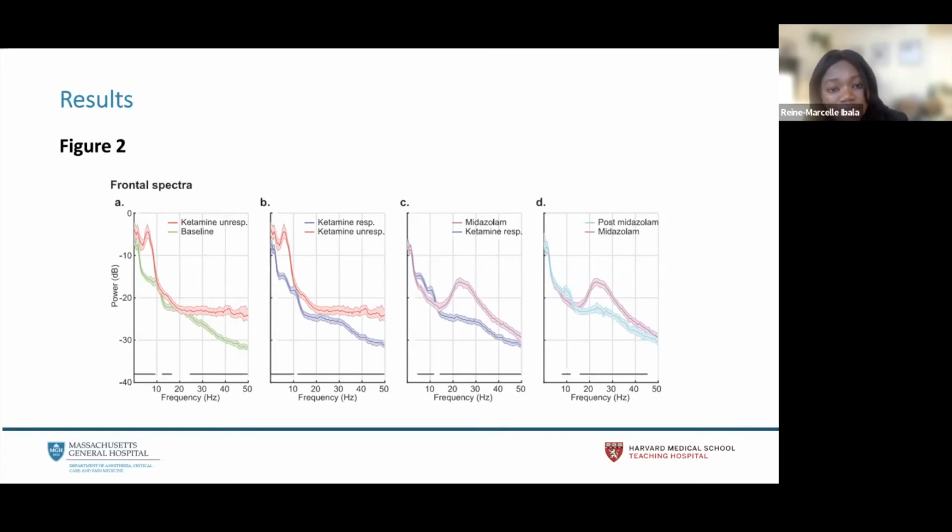Then as we move into our sedated range in the next panel in figure 2B, you see an approximation of this blue line for dissociation that matches more alongside with the baseline actually in terms of the dynamics that it's showing as compared to the sedation level. From sedation to this dissociative state, we see a decrease actually in those theta and delta wavelengths, and then also a decrease in that gamma wavelength. That's what happens before the midazolam administration.